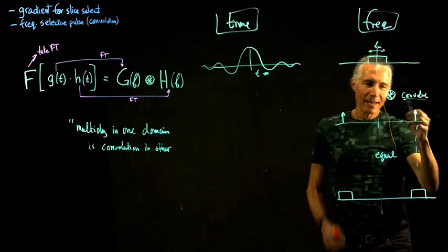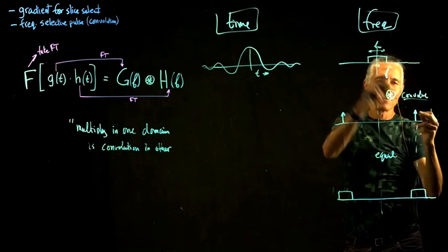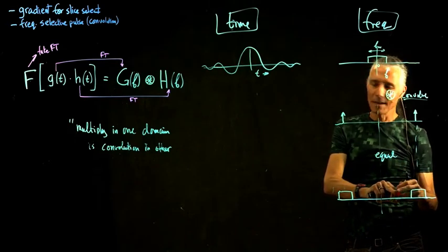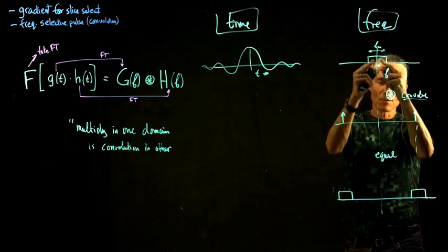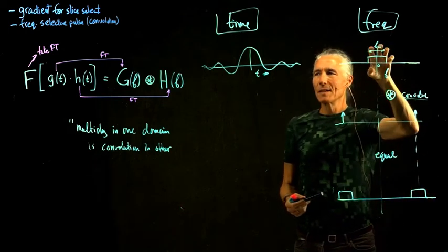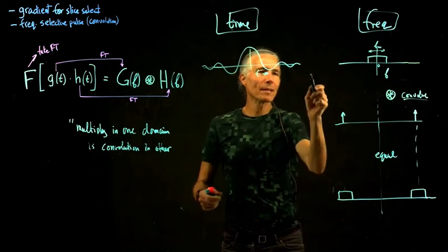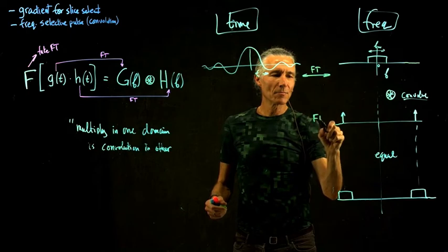When you convolve anything with a spike, it's going to basically just make a copy of that thing that you're convolving with the spike wherever the spike is, because it'll be all zeros here. If you work through the convolution equation, everything will be zeros here, and it'll only be not 0 where it's within this width of the spike. So the spike will make a copy of this filter function wherever the spike is. So now, remember, we can go back and forth with Fourier transform on all these. So this goes back and forth. So now we're almost there.